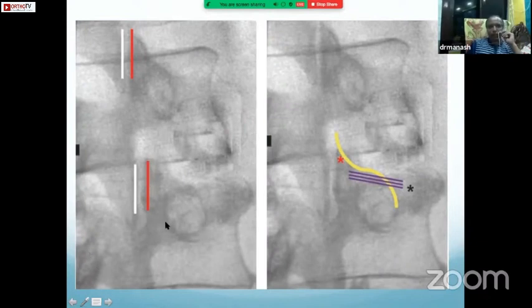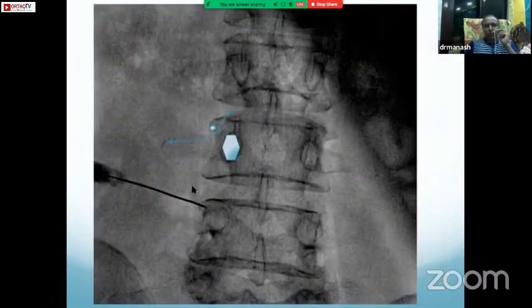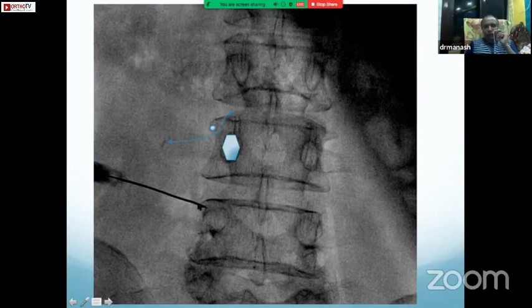This is the pedicle, which is appearing as the eye of the Scotty dog, and this is the area between the ear and nose. This is the tunnel, which is covered by a mammillo-accessory ligament and forming the tunnel here. So this is a strict AP view, which is outlining this pedicle and the target area. So now you can see the needle here. This is a bit different from the other procedures, where we are targeting the area upper and outer to the pedicle.